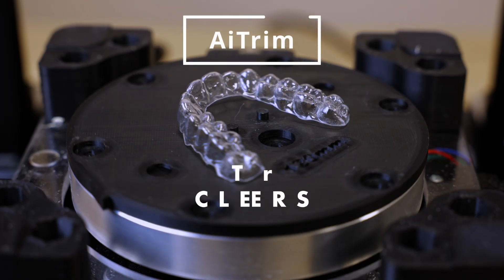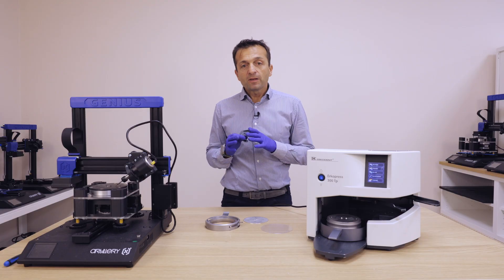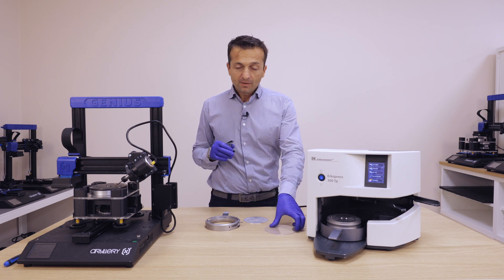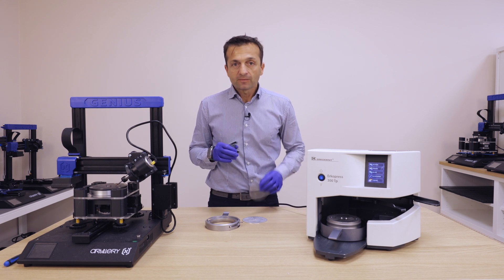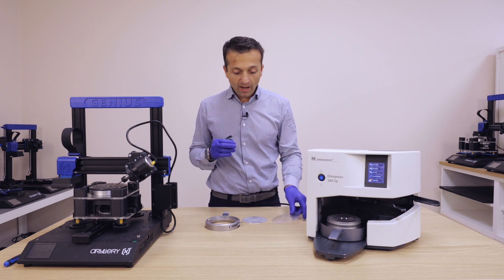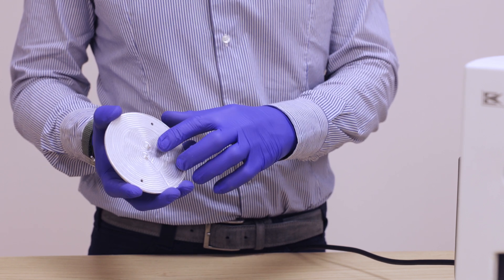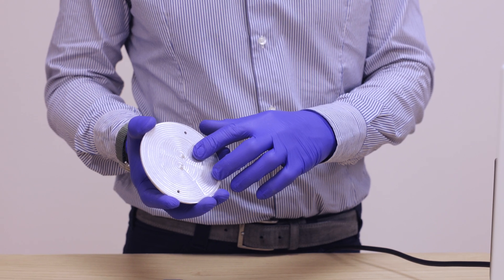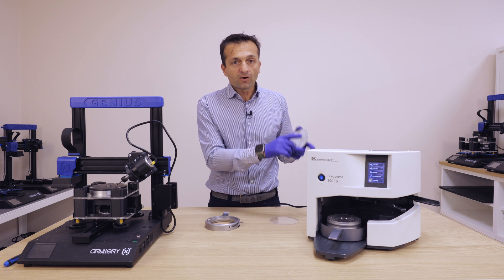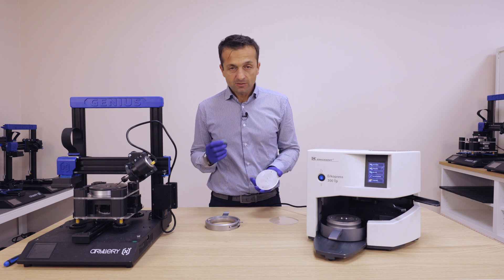To be able to transfer the exact position of the sheet that you will thermoform — from the thermoformer to the trimmer — you need this special plate with two pins to connect your model. This way you will be able to transfer the exact position from thermoforming to the machine and have the best cut possible.